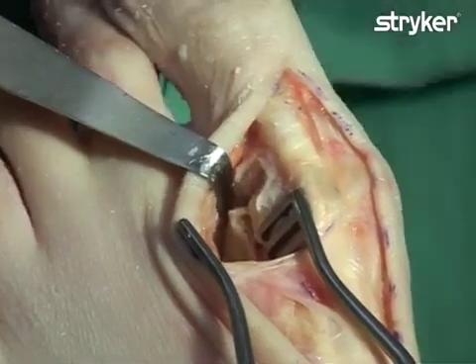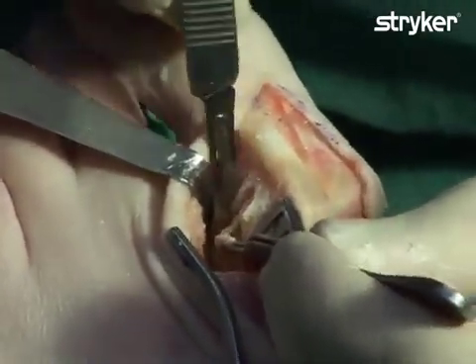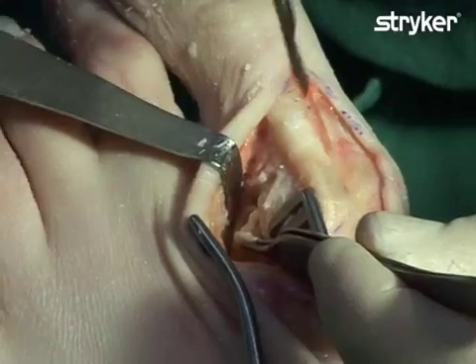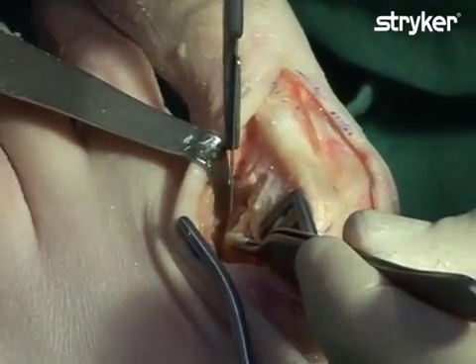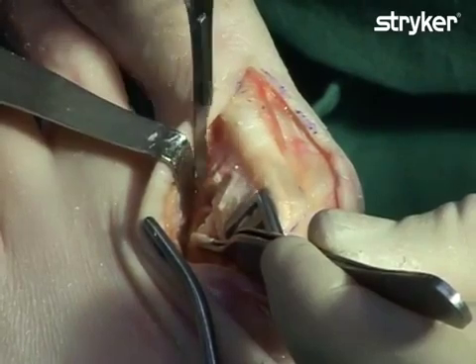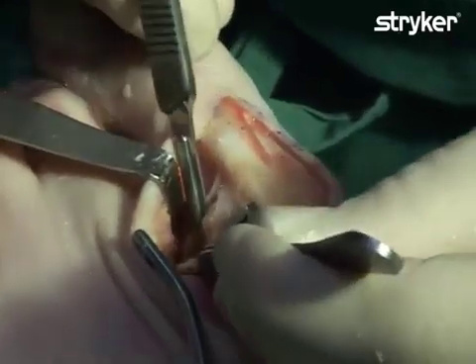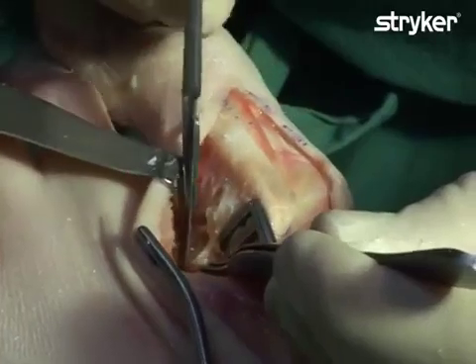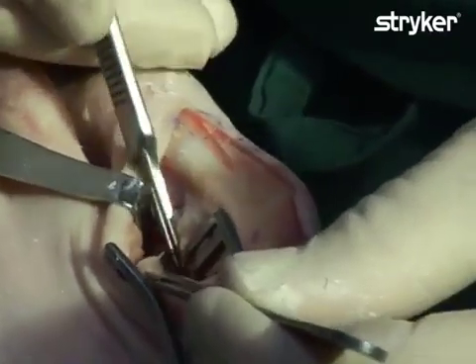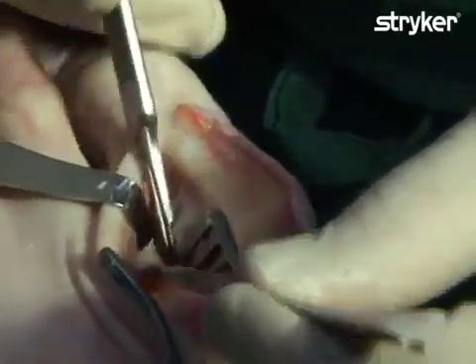The adductor tendon is then detached from the sesamoid using the so-called J-stroke cut. When using the J-stroke, the surgical blade is inserted into the interspace, around the tendon and up at the sesamoids. The motion of the blade resembles a J-stroke. After the J-stroke is performed and the tendon has been dissected from the metatarsal, the tendon will be completely released.